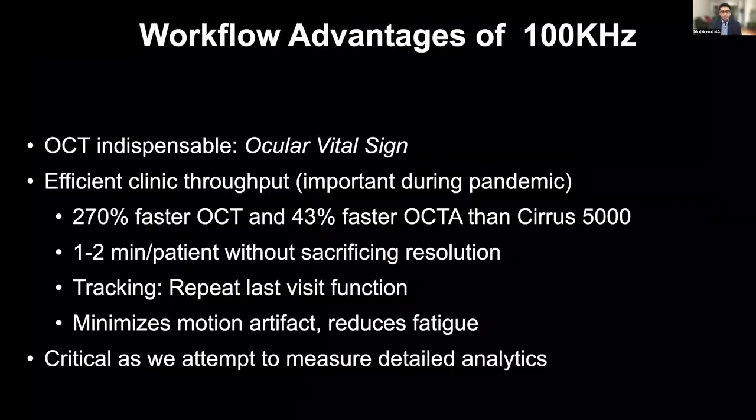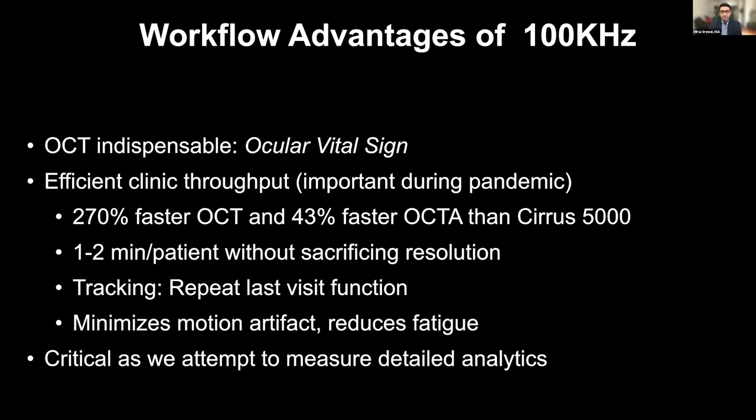So this really tells us that OCT is indispensable. In fact, I consider it to be an ocular vital sign that I obtain on almost every single patient that I see in clinic. And this really brings us to the importance of having an efficient clinic throughput, something that we have recognized even more so during the pandemic.